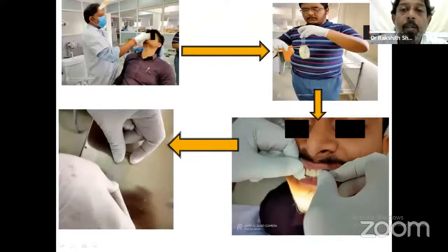So this is the process. First the patient is cleaned. There is a cellophane tape, a small piece removed, and it is attached. The imprints were taken, and after taking, they are directly attached to the slide. The procedure is as simple as that.